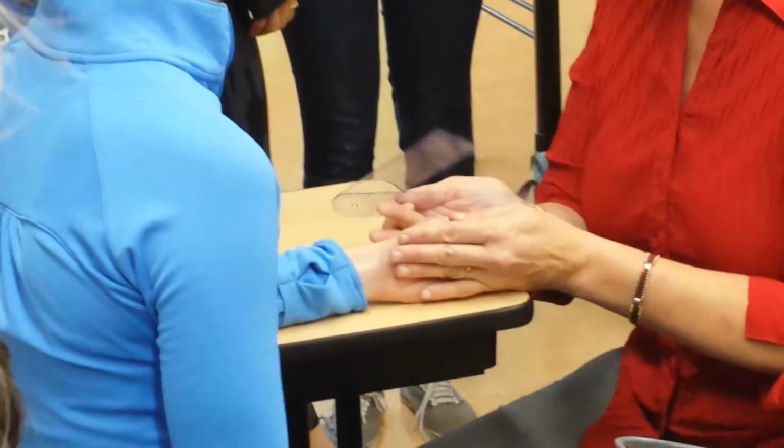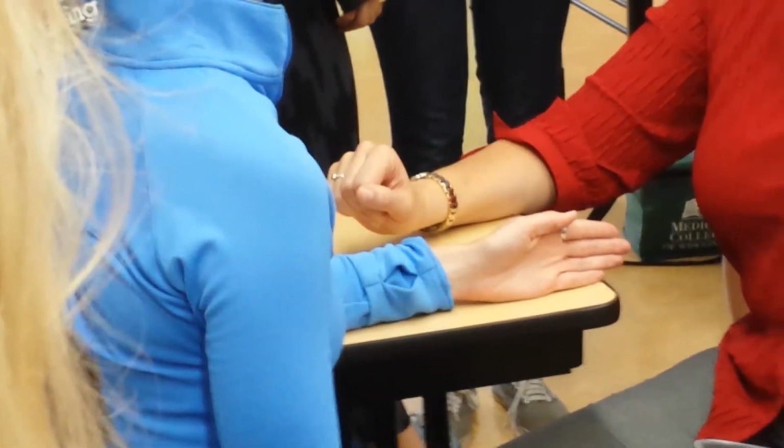Now, I'm going to have you start with your thumb in that position. So the thing that's wonky about some of our thumb measurements is our starting position. Our goni is not going to be in a convenient starting spot. So it's not going to be at 0 or 90 or 180. It's going to be at 17. And so you're going to have to do math. Okay?